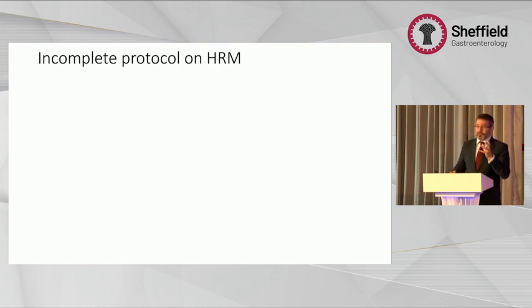As we said in the beginning, the majority of these swallows are performed with 5 ml of water. But none of you ever have 5 ml of water at a time. You go and eat, and then you complain if there's a problem when you eat. So why don't we do the same with physiology studies? In fact, it's not done commonly, and it's important for us to do that.